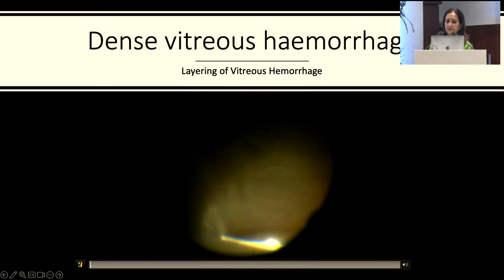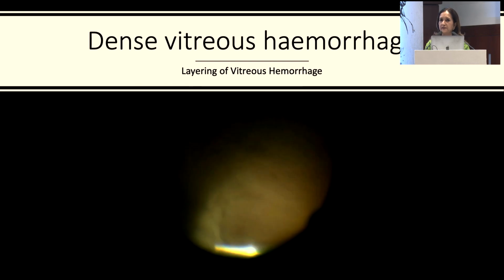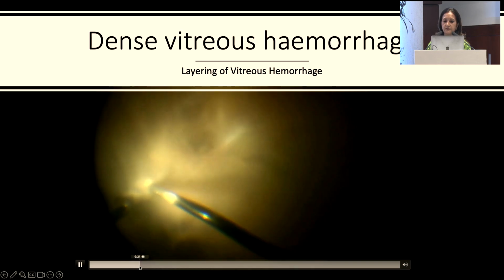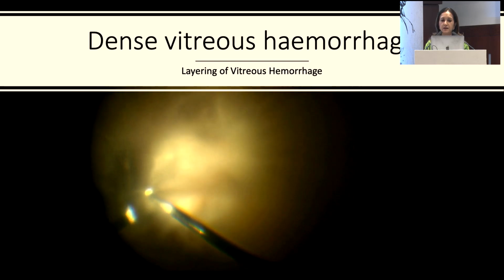So this is in dense vitreous hemorrhage. Dense vitreous hemorrhage with underlying retinal detachment is something where you need to be very careful, because you don't know while you are cutting where the retina is lifted up, and you may end up cutting the retina to begin with.